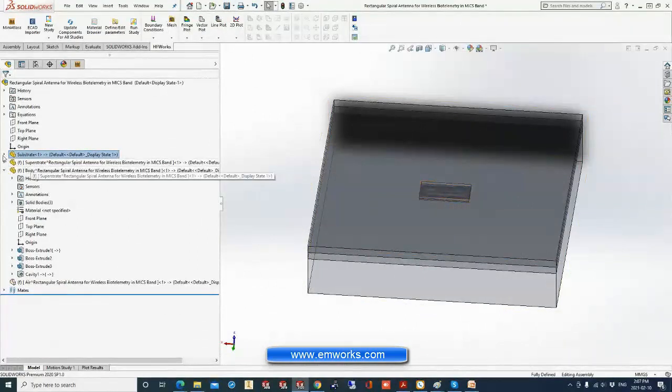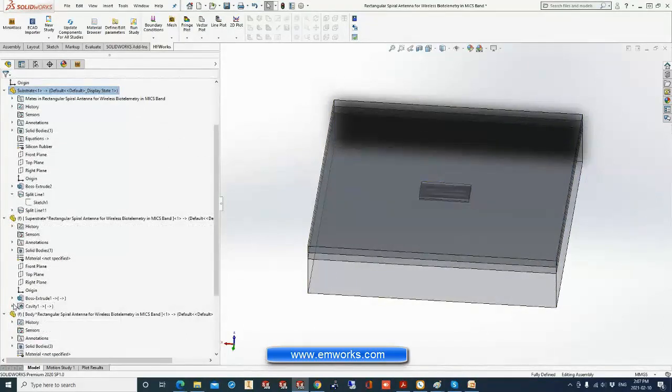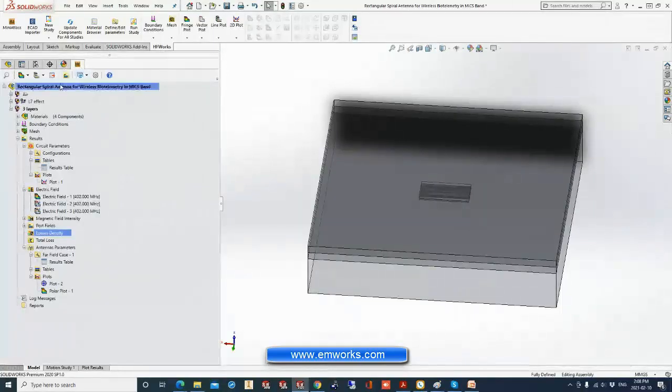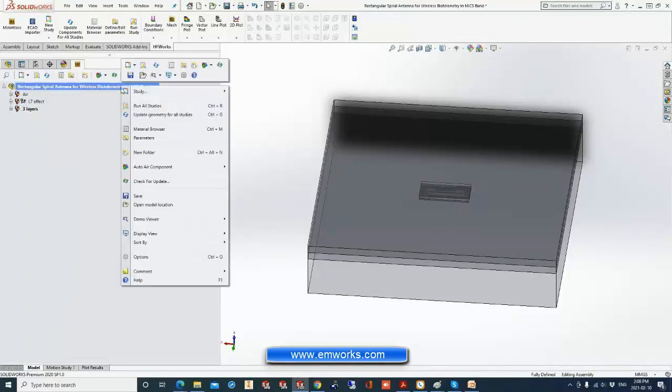Also, there is a nice feature inside SOLIDWORKS which is called cavity. The cavity function subtracts a part from another to avoid any interference. So this is the geometry, and you come here to HFWorks. In HFWorks, to solve any RF problem, you simply create a study, which is called study here. It can be an antenna problem or an S-parameter problem to compute the scattering parameters.